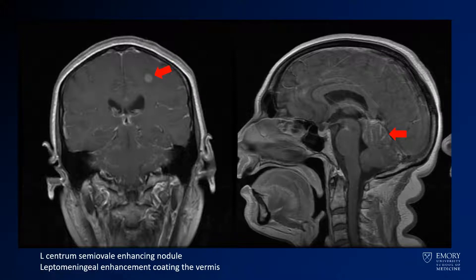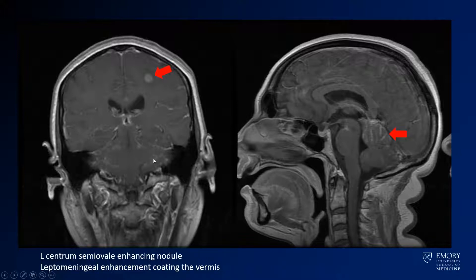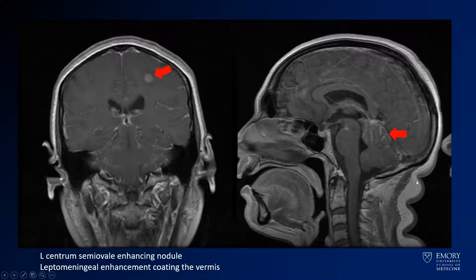Coming up higher, you start to see the abnormalities in the upper cerebral hemisphere — there is an enhancing nodule there. And then looking at the posterior fossa, this is a classic appearance of leptomeningeal disease. You have this hazy enhancement that follows the sulci, seen nicely in the interpeduncular cistern and in the folia overlying the superior aspect of the cerebellum.